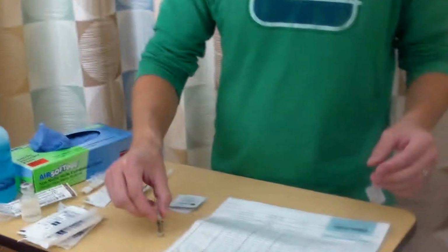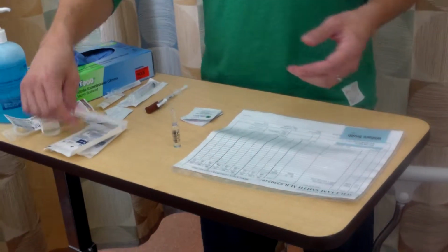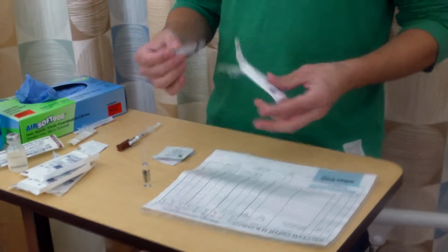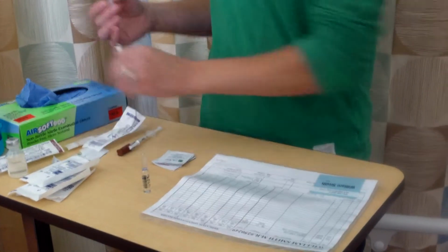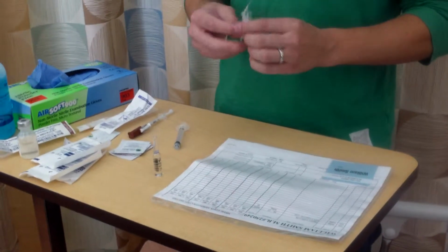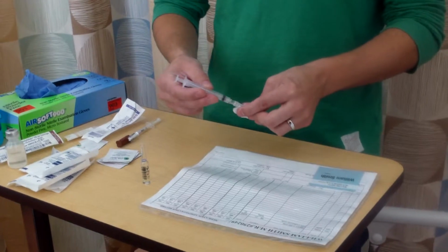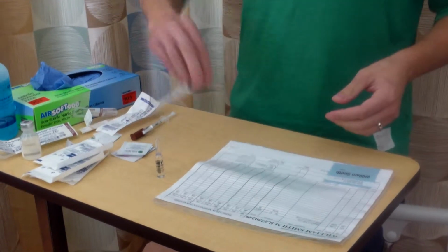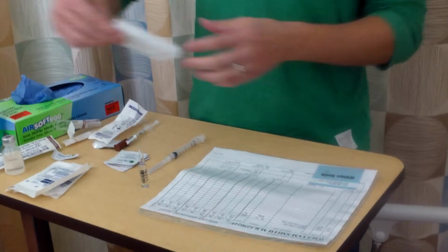The next one I need to do is subcutaneous from an ampule. So I'll get my supplies ready. I need to have 1 milliliter, so I'm going to use my 3 milliliter syringe. I also need a filter needle because I'm doing this with the ampule. So I have my filter needle. Put that on.